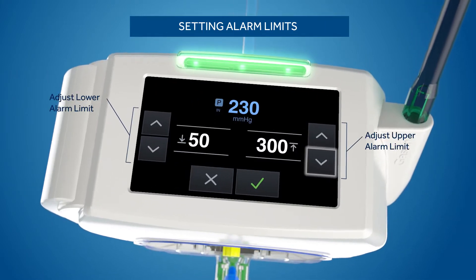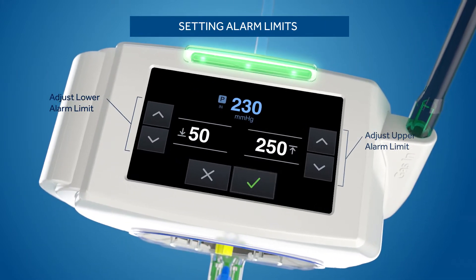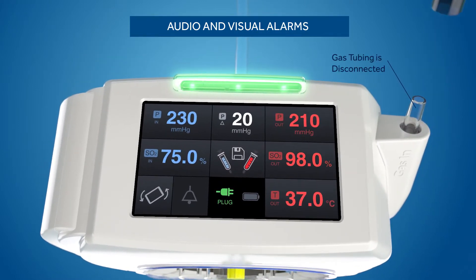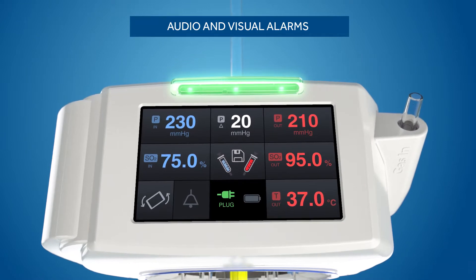Utilize the touch screen to set alarm limits. The module gives you audio and visual alerts when alarm limits have been exceeded. Here, the oxygen gas flow has been disrupted.